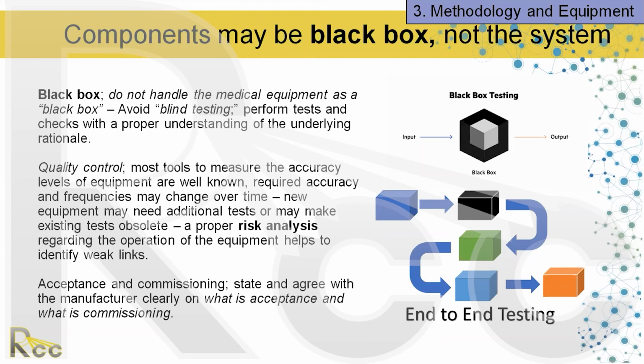You should be aware of their limitations, but you shouldn't treat anything as a black box. Just because you don't understand the mathematics behind the specific transformation doesn't mean that you can't assess it in a way to look for errors. I think image deformation is really a dangerous one, but it can go really wrong with, like, a liver. It can create swirls and things like that. So you don't need to know the math, but you should be aware of where it can go wrong.